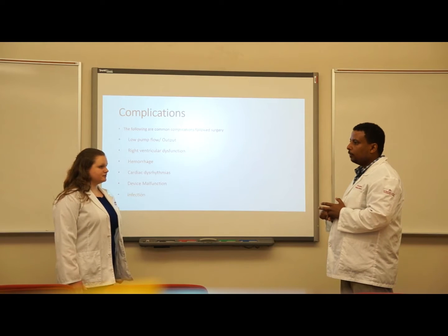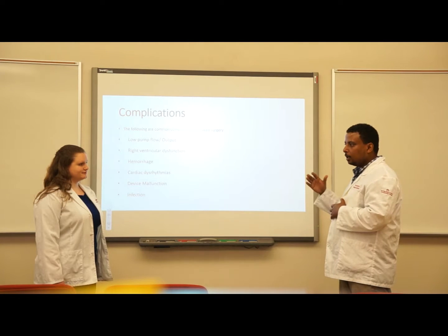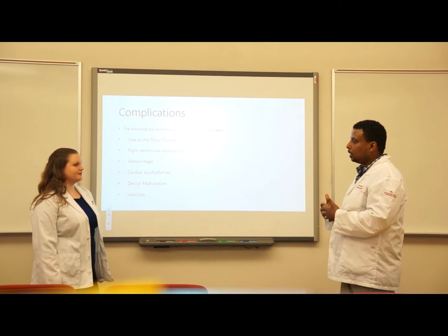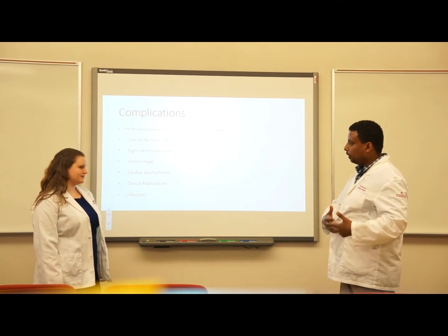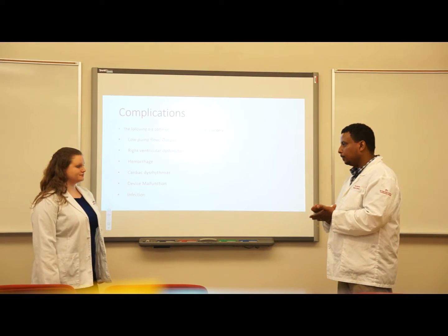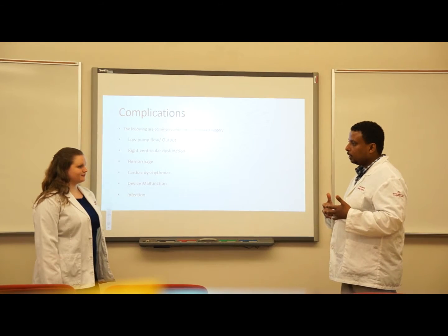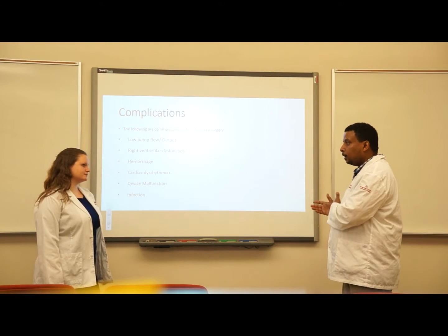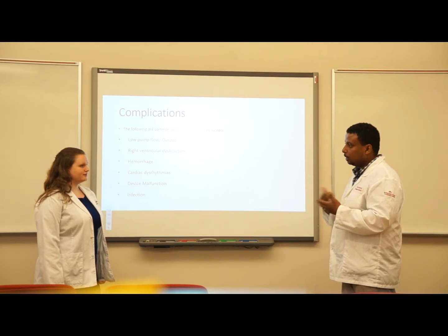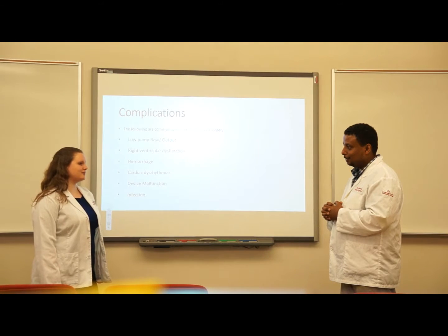Okay, so if I understand this correctly, a bridge would be something until they get a heart transplant? Exactly. Or until they recover from conditions such as cardiogenic shock, where the left ventricle gets weak and needs support. Okay, so that is the bridge. Yes. And destination is for those people who are chronically ill and are not qualified for heart transplants. Correct. And they get the destination. Exactly. And that is for the rest of their life.